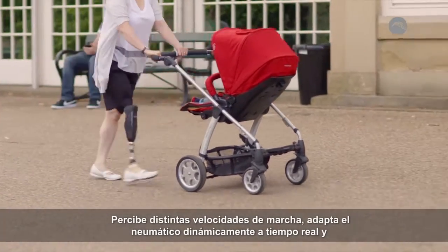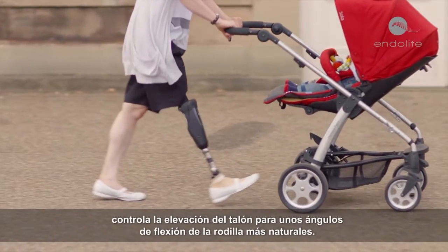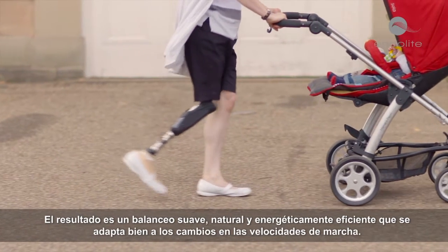Orion 3 can sense different walking speeds and dynamically adapt its pneumatics in real time to control heel rise for more natural knee flexion angles. The results are a smooth, natural and energy efficient swing that adapts well to changes in walking speeds.